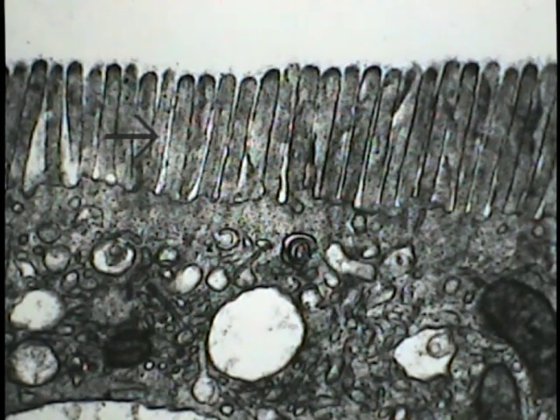This illustration is a transmission electron micrograph of the striated border, or the microvillus border, illustrating some of the microvilli extending from the surface of an intestinal epithelial cell. So this is the electron microscopic version or depiction of the individual microvilli forming the striated border, as was seen with the light microscope.